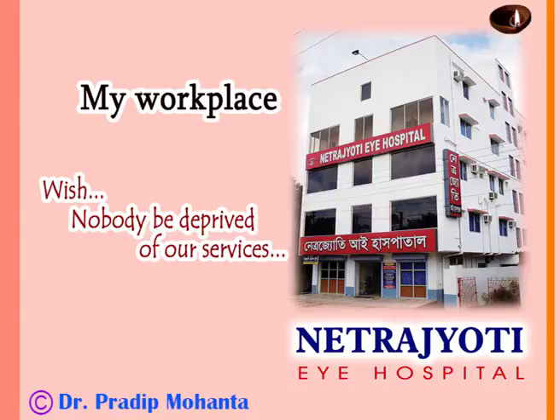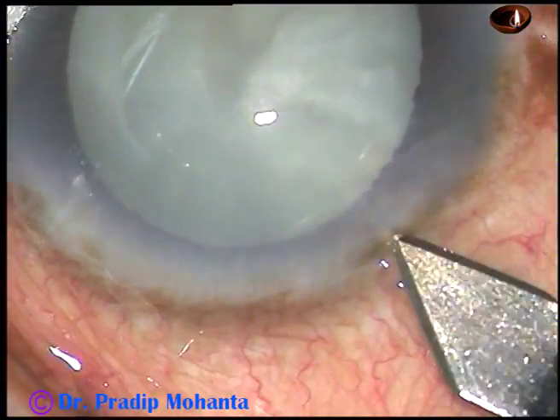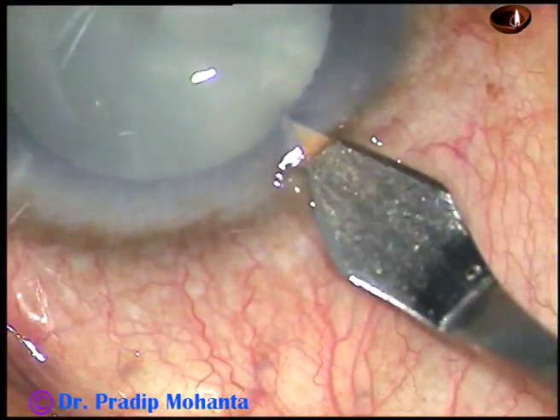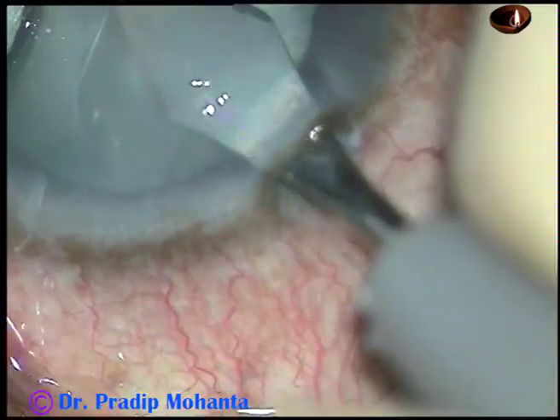Friends, welcome to my hospital at Rana Ghat, West Bengal, India. This is an intumescent cataract with very shallow anterior chamber and a soft nucleus. Let us observe the surgical steps.